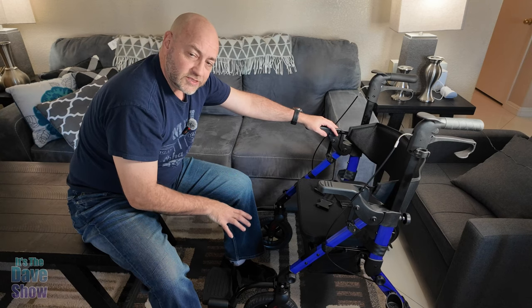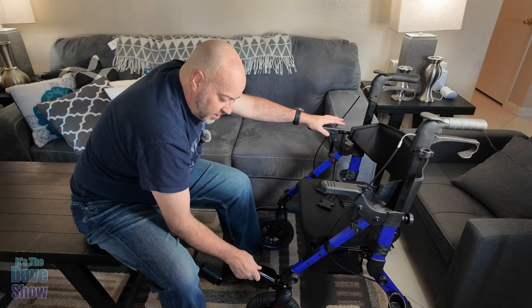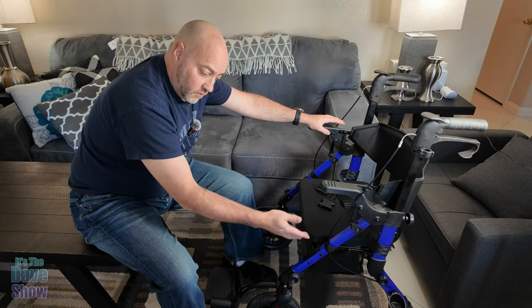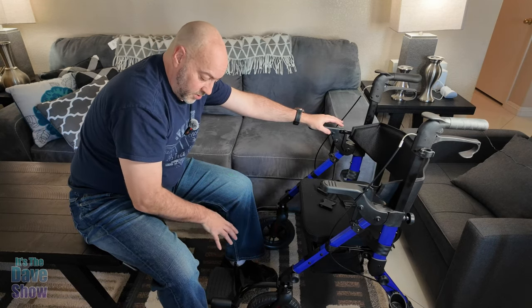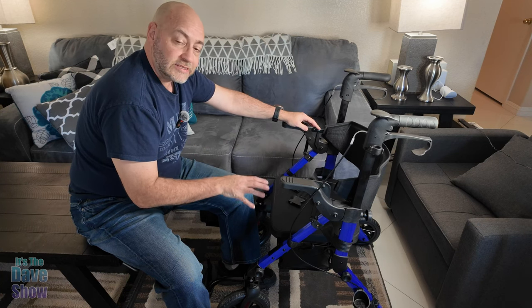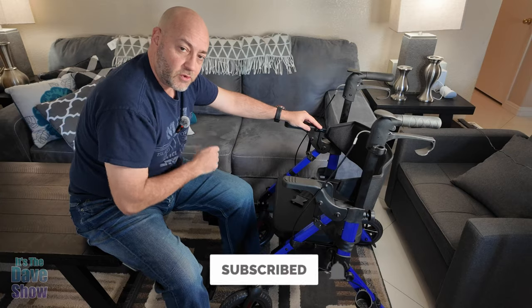The footrests are not designed to stand on and are intentionally not locked in so they can be removed or repositioned easily, as I showed earlier. They're foldable so you can get them in and out of the way. Overall, this is a very nice walker transfer chair/wheelchair combination. If you're looking for something like this, this one may be the right one for you.